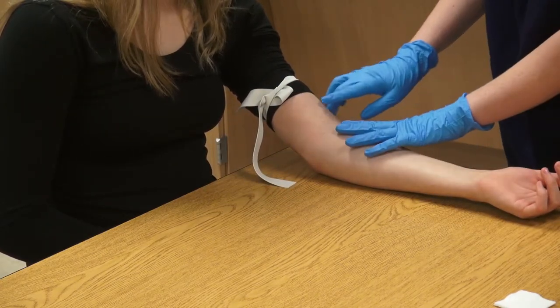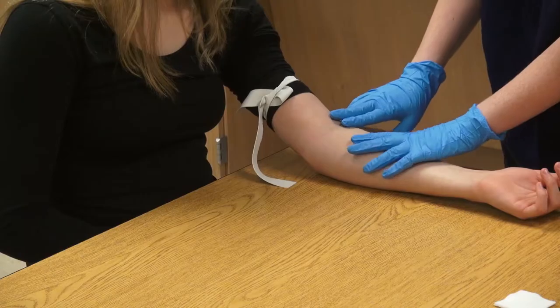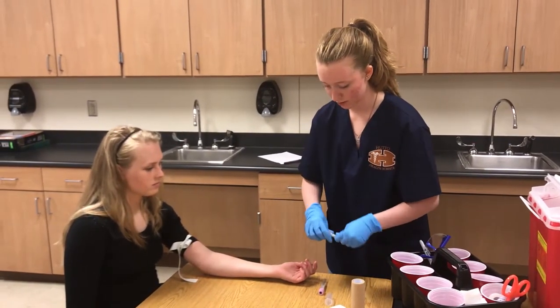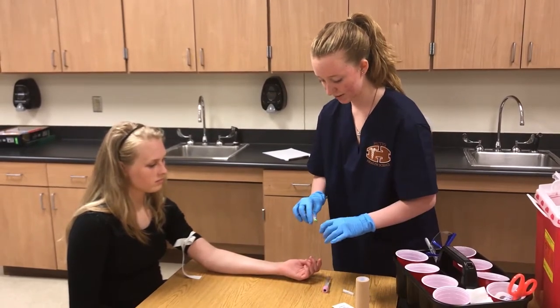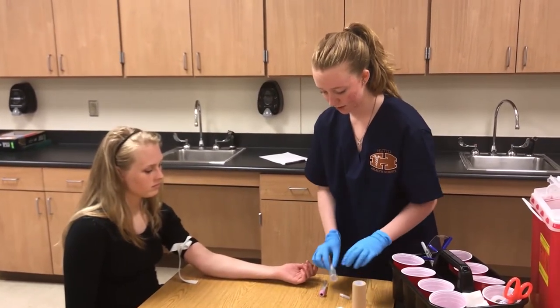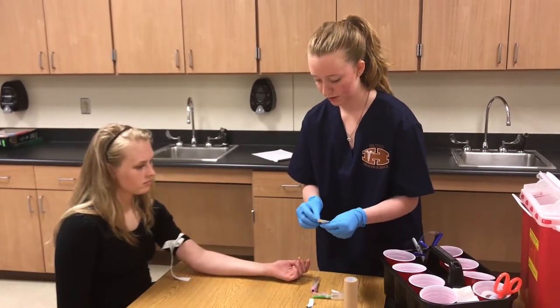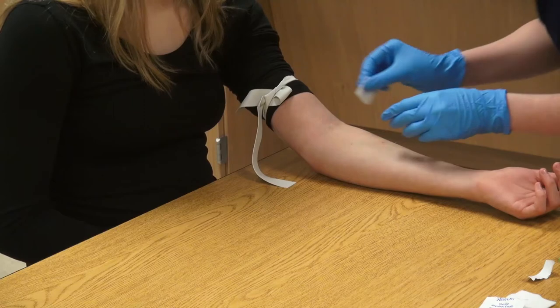As you can see, her veins are very palpable, so you will not need to squeeze anything to bring them to the surface. Next, clean the site using a circular motion.